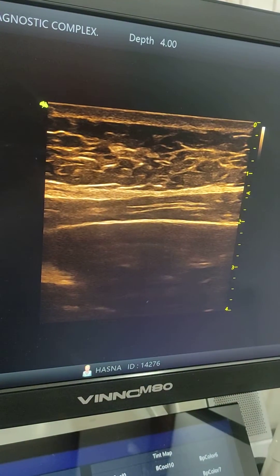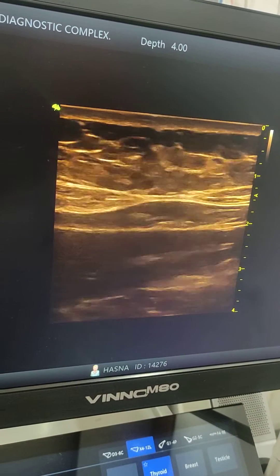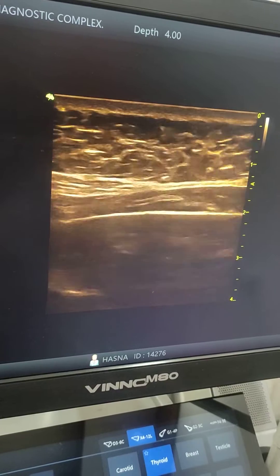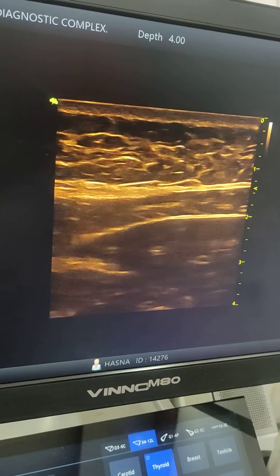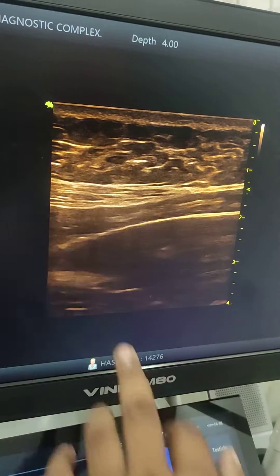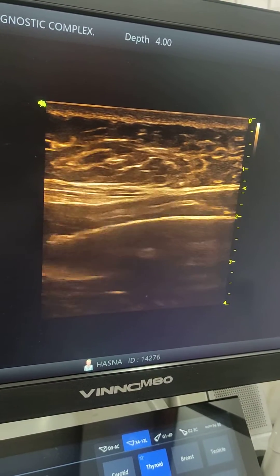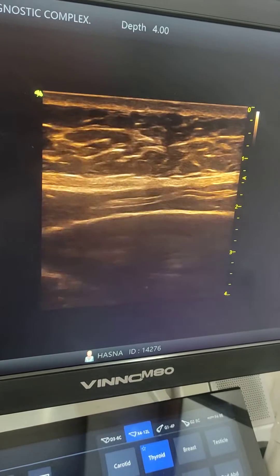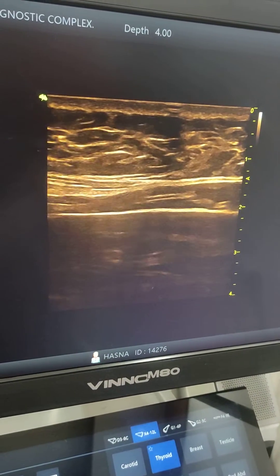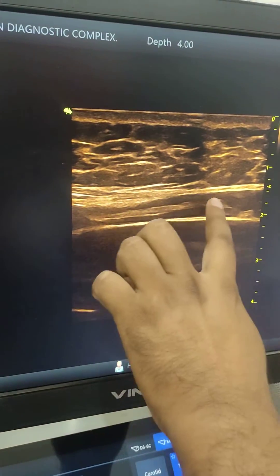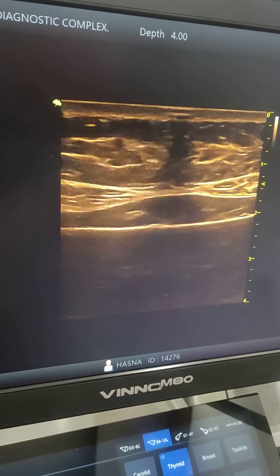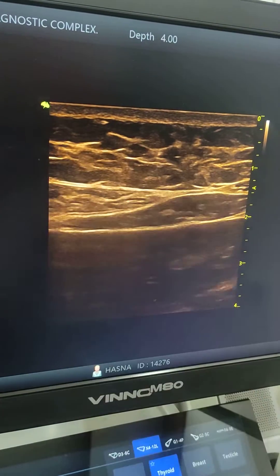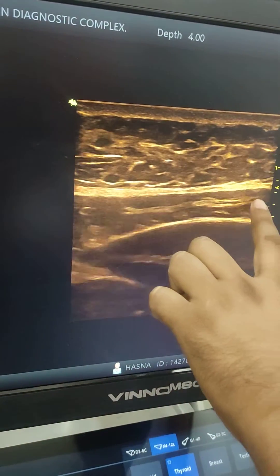This is worms — Ascaris lumbricoides seen in the main pancreatic duct. This is a tubular structure within the main pancreatic duct. Viewed in transverse and oblique planes, these are the worms.